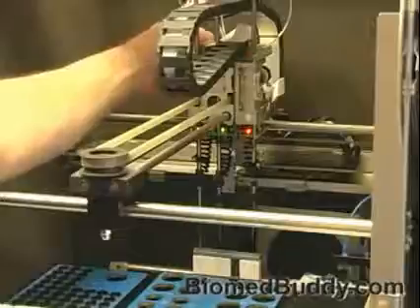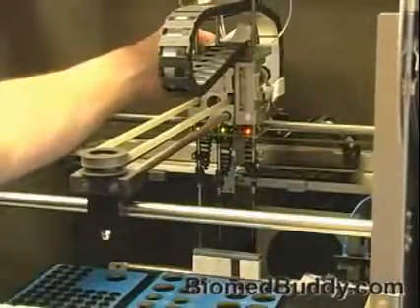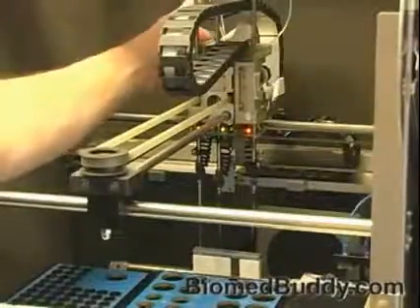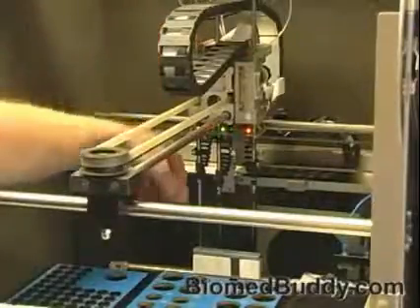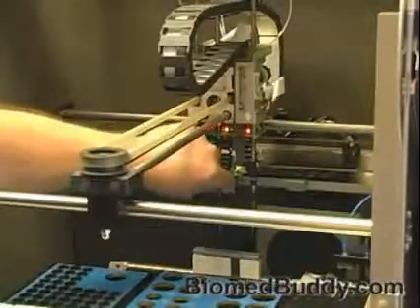Okay, now you can tell that that is going right into the center. I'm going to do the same for each needle. And needle number 3 is the interesting one, but regardless of that. Okay, and it goes right back in. Now that's fine. That just means that my needle is centered. Now we're going to go to needle number 2.